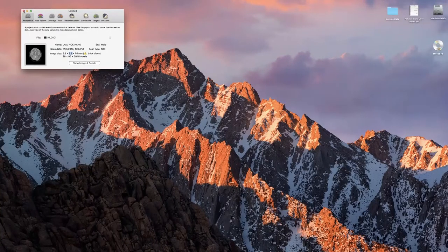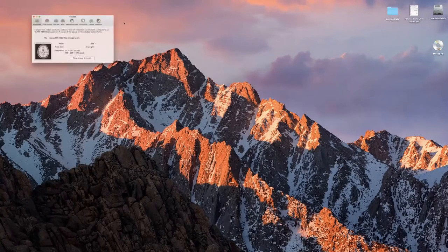What we're actually looking for, ideally, now I don't know, because I don't have a neuroscience background, I don't know if in the step before you can resize those images. So when you take the image out of the MRI scanner, when you're using matrices and stuff, I don't know if you can resize it, but you're ideally looking for 1 by 1 by 1 instead of 2.5 by 2.5 by 1. So when we look at, if we look at our kind of, no, not that one, apologies.